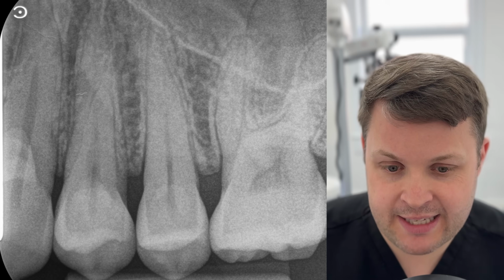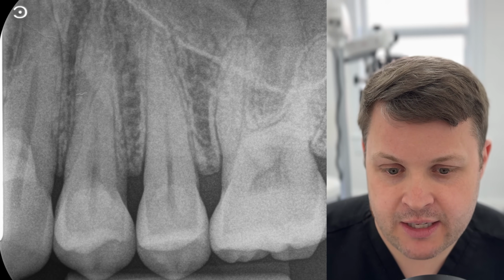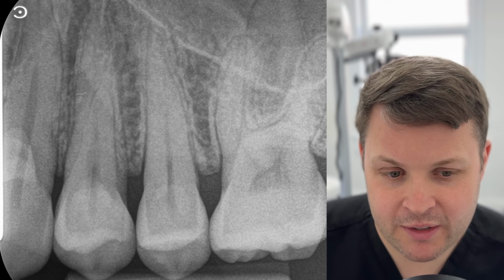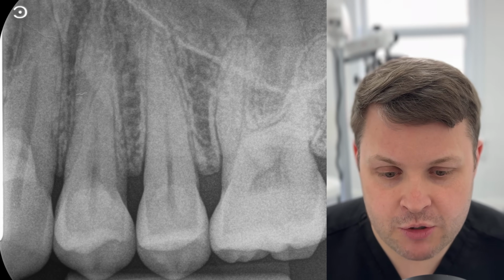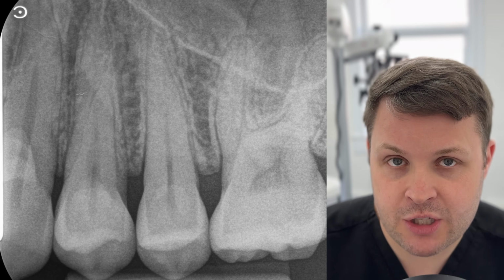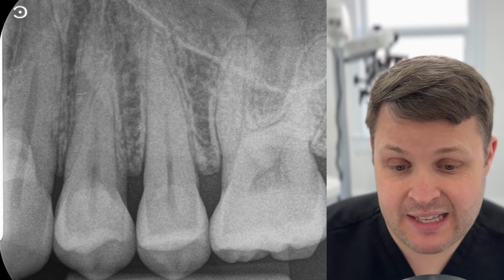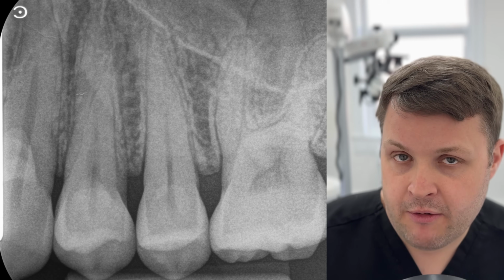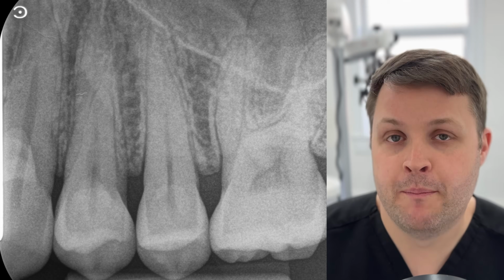But when we look at this x-ray, we're kind of thinking to ourselves, has this tooth got 2 canals, or has it got one canal? And to me, it's obvious now that it's got 2 canals. But at this point, sometimes when you're looking at x-rays, you can see the radiographic presentation of the bone, it's not so obvious. I think a bit of a red flag for me is that the canal space disappears. And when it disappears further down the root, it usually means there's a bit of a split, or there's complexity.